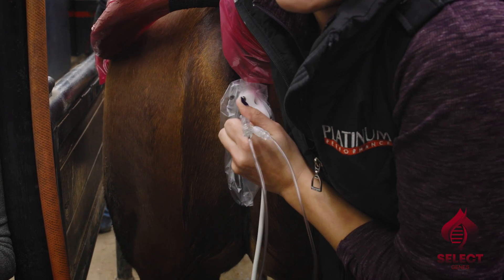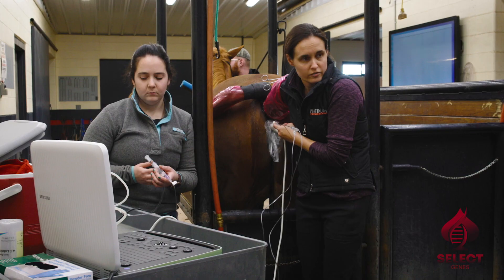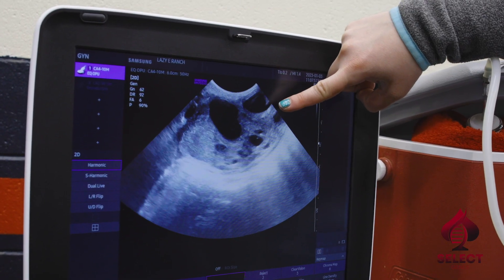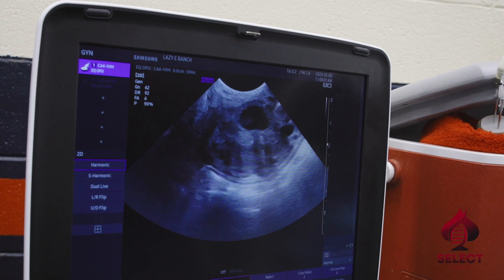We know that there's a single egg in each one of those follicles. So what we're going to do is go in each follicle — it's kind of a blind scrape. The eggs are attached to the wall of the follicle, and we're just hoping that we're going to use good technique and get a little bit lucky and get as many eggs out of those as we can.